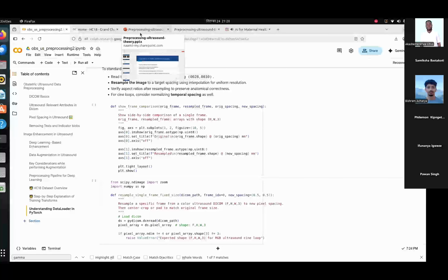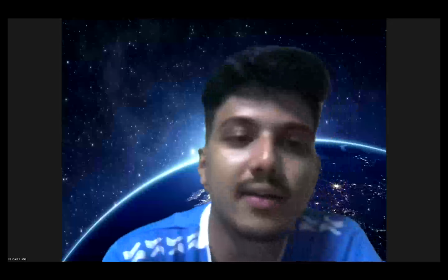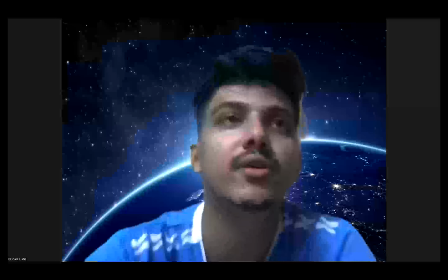So the first question is, what are ultrasound models usually trained to do? There are countless things that you can do with ultrasound models. From what I showed you, you could do screening, like finding gestational age to monitor the growth of the fetus.